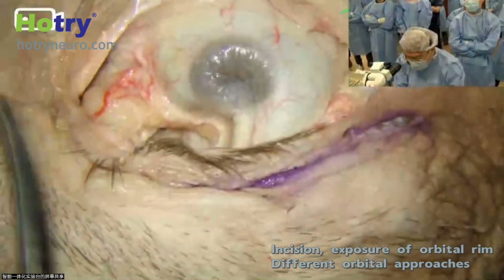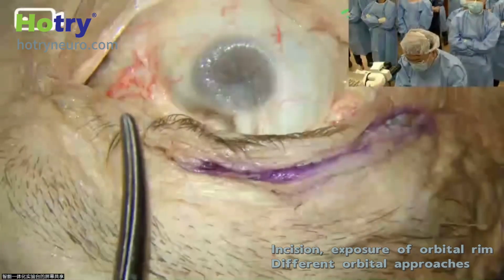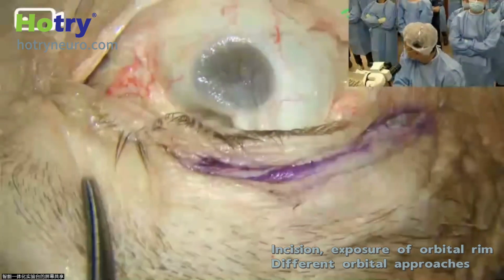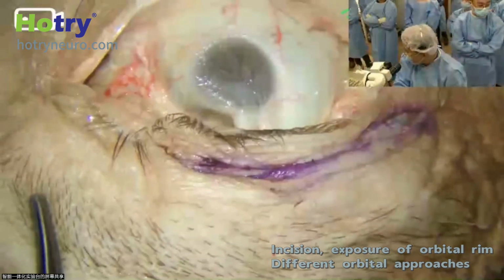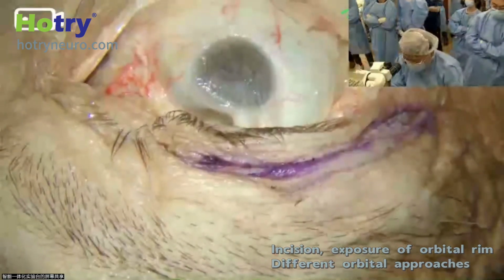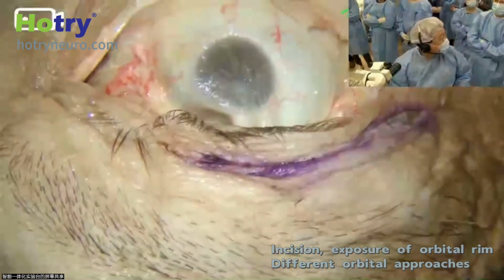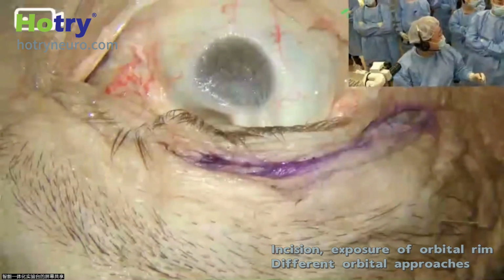So bear in mind that the superomedial part is difficult because of the supraorbital neurovascular bundle, as well as the trochlea and the superior oblique muscle. So if you are operating on that area, I think it's better to get an ophthalmologist with you. So much for the periocular incision. This is just the start of the transorbital approach. If you have no question, maybe you can go to your table to try.